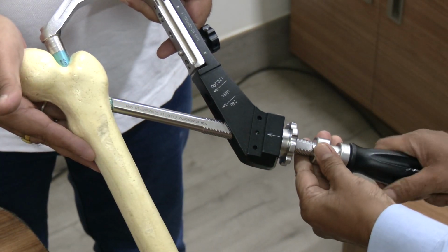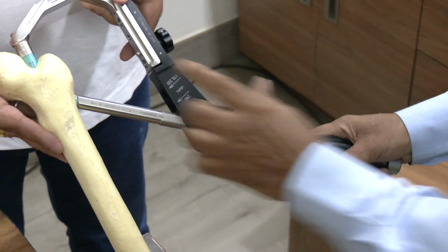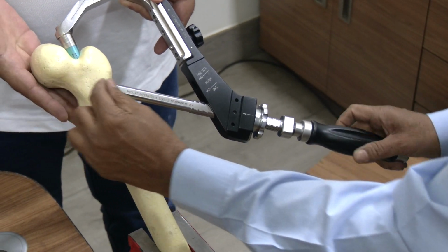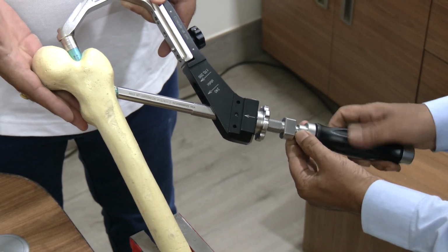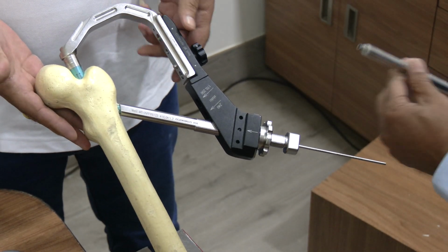Okay. Now I am taking out the screwdriver. This will compact the fracture. Since there is no fracture here, that helical blade will come back. But in an intertrochanteric fracture, that will compact the fracture. Once the compaction is over, it will come back in this fashion.